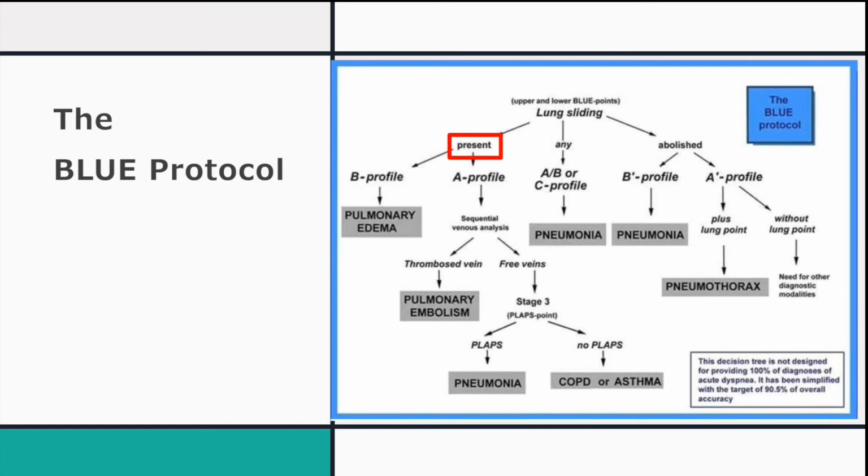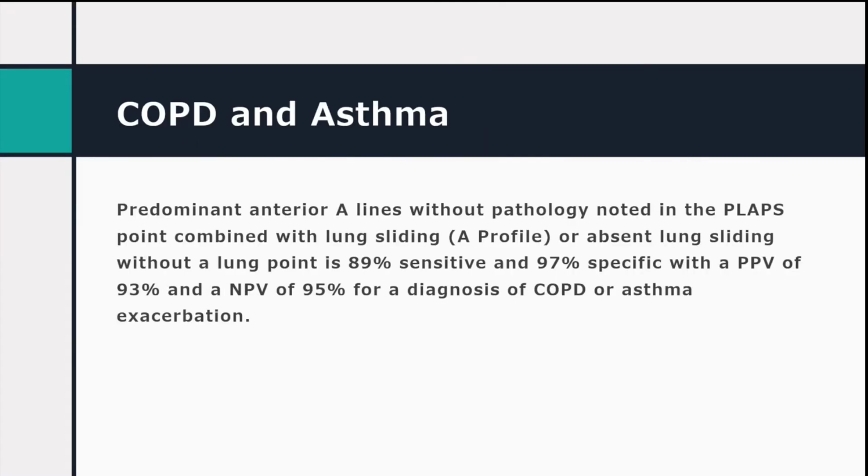So again, it's important to remember that this study was designed to look at the 6 most common things that comprise like 97% of acute respiratory failure diagnoses in critically ill patients. So that's not saying that that's all it could be, but likely it's one of these 2 things if we've excluded everything else in this pathway. All right, so that's just basically what this slide here says. We have a pretty good positive predictive value and negative predictive value, based again looking at those 6 diagnoses.